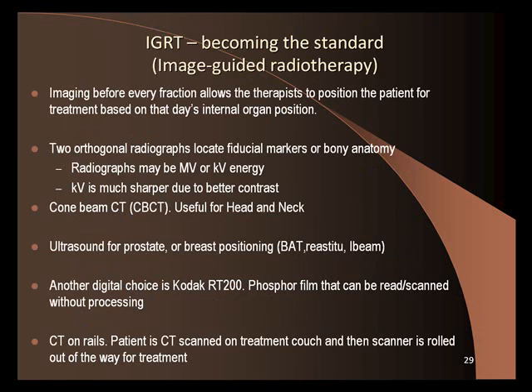Okay, IGRT. So this is another topic. I told you we're going to cover a lot of topics, and it's all kind of the same thing. It's all imaging stuff. Okay, so IGRT. We're going to do this quickly here. Image Guided Radiotherapy, very common today. You could do IGRT with MV imaging or KV imaging. The MV imaging IGRT has probably been around the longest, and then KV imaging came around after that.